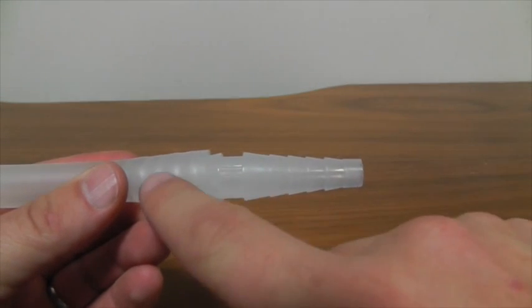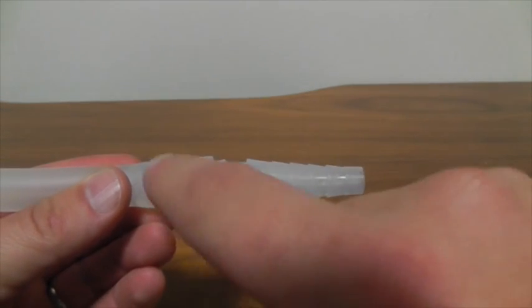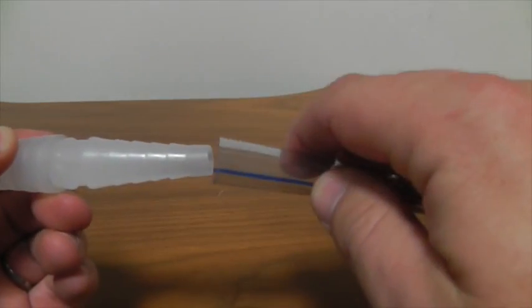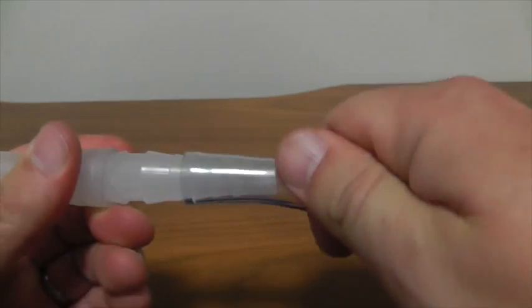Okay, so once your chest tube's in, it comes with this connector already attached to the tubing that goes to your drain. Once you're sure your tube's in the right place, you push it on.